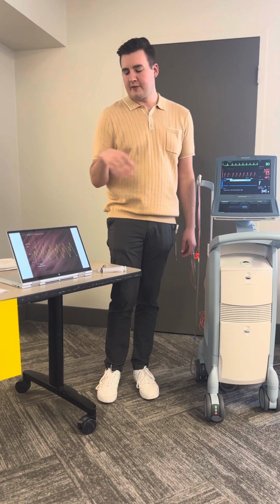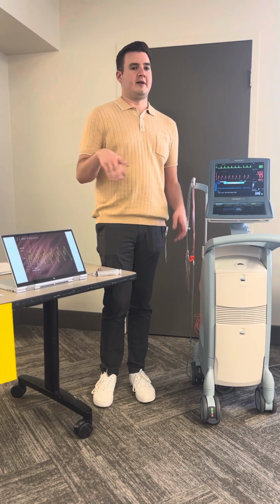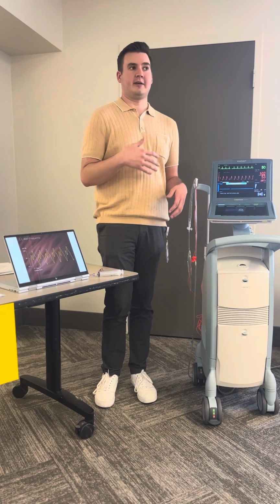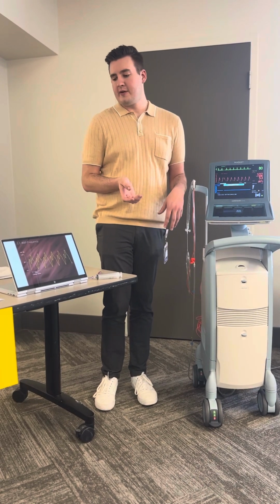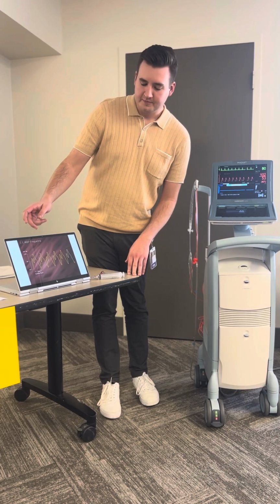And so there's some things we have to document. Like every hour, we need to be documenting our pulses and our sites because, of course, the balloon shifts, something like that. It can occlude blood flow, or if there's a clot or something like that. So we check all our pulses every hour. There's also a few pressures we need to chart every hour as well.